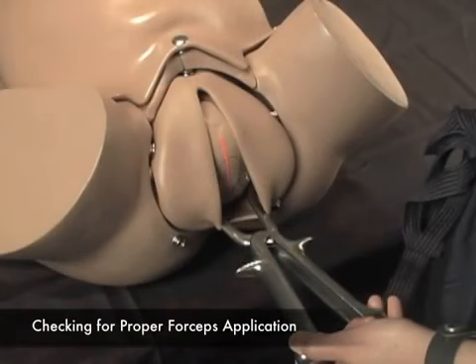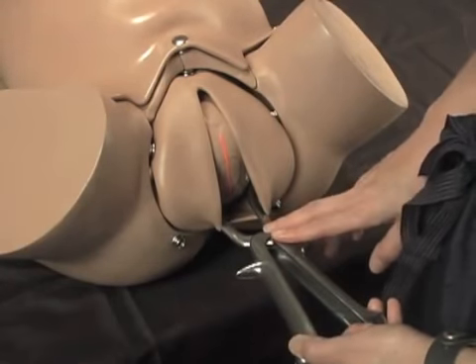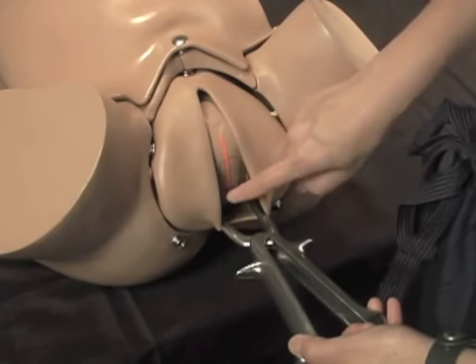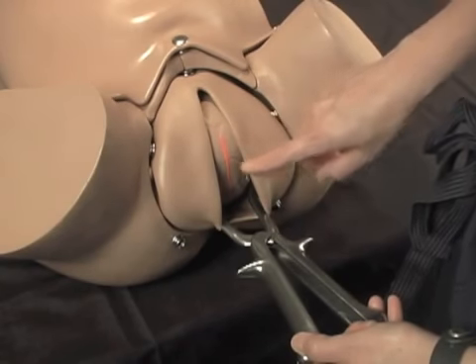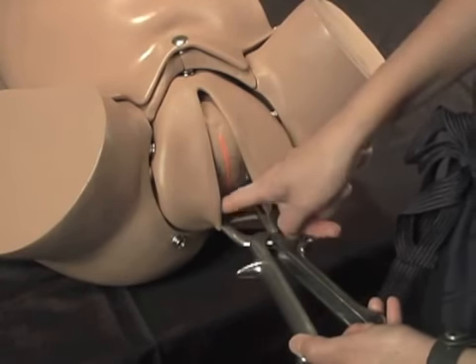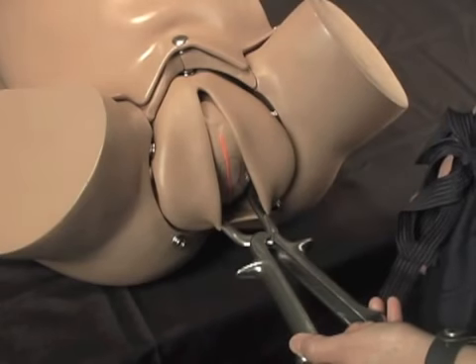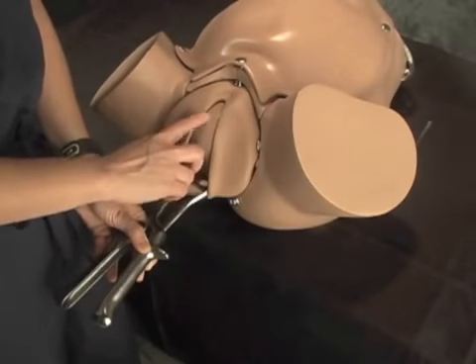Check for proper application prior to locking the handles. The sagittal suture must be perpendicular to the shanks. The posterior fontanelle should be midway between the shanks. Fenestrations of the blade should be equal on both sides and barely felt. Check proper forceps application prior to applying traction. Check fetal head position.